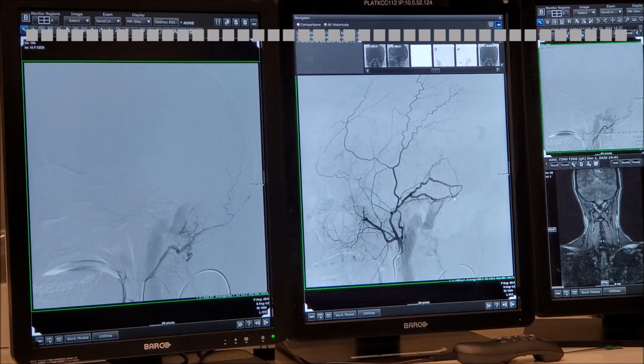They're going to bring it to the United States. I can't remember the name of the balloon, but it's a very nice balloon. If you don't have the balloon and you want to save the sinus, you could put a Wallstent, and then you do the injection of the liquid embolic through the meninges. It really works very well too.